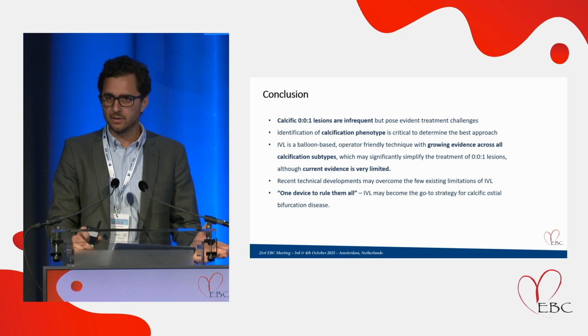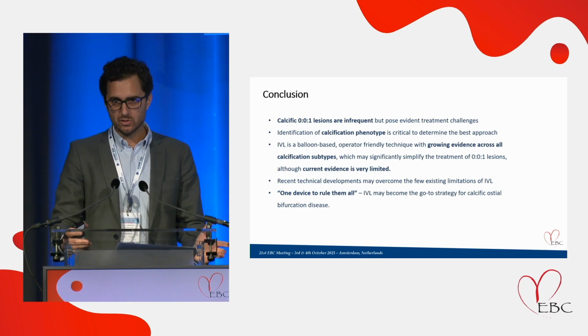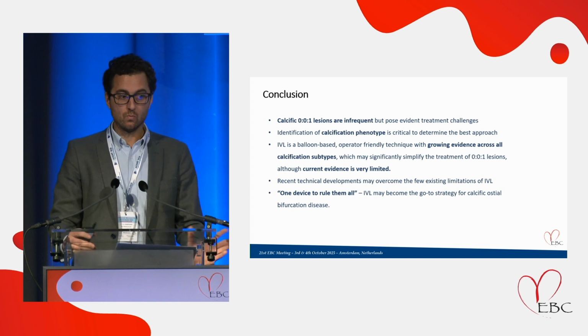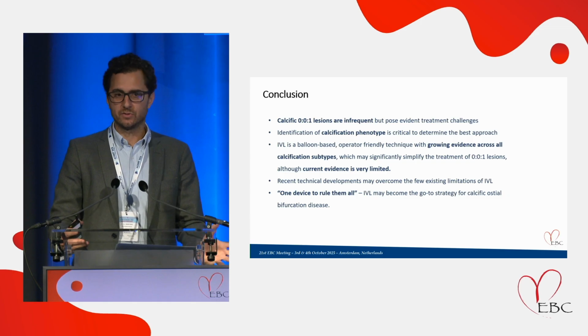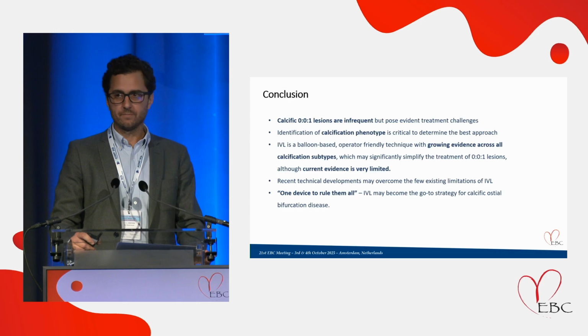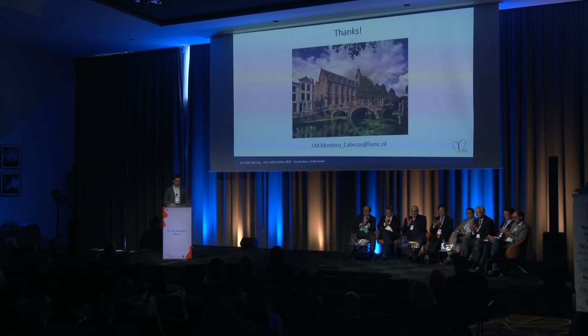Current evidence is, of course, very limited, and the limitations that we have, like uncrossability, might be solved in the future. So, one device to rule them all, we will see, but IVL may become the way-to-go strategy for calcific ostial bifurcation disease. Thank you very much.